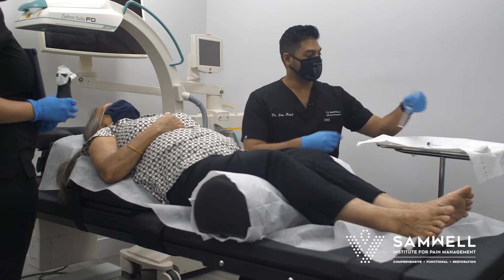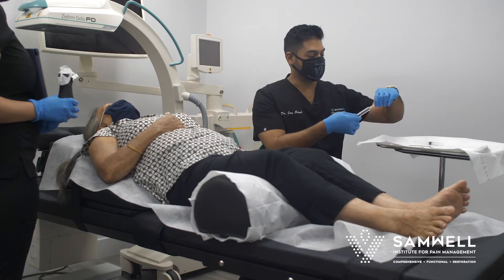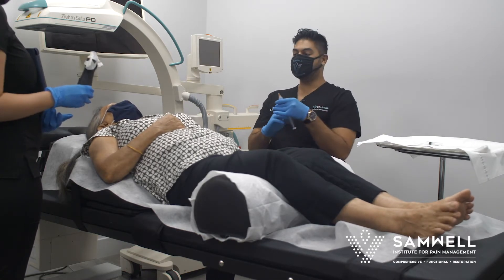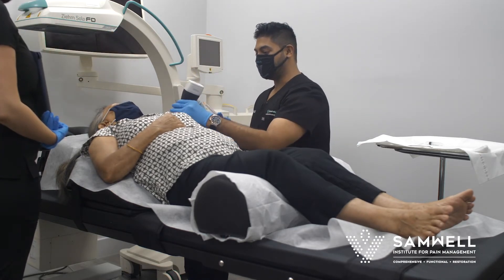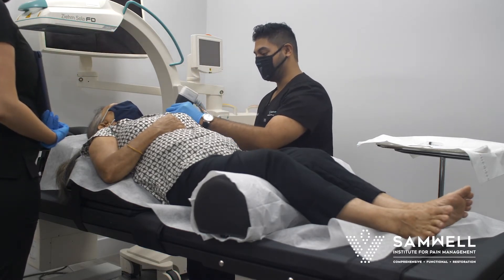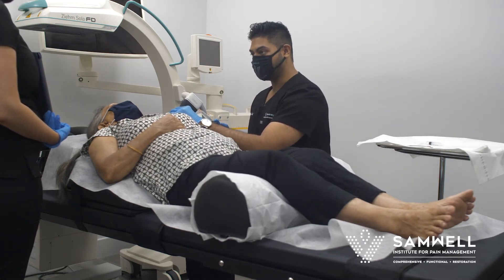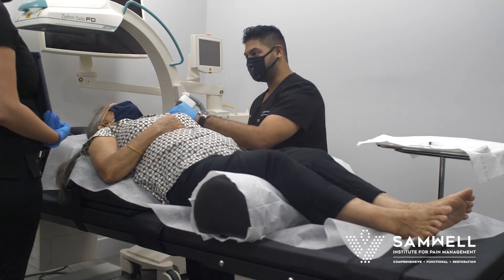We just prep the area here with some antiseptic solution and we're going to localize the skin. We'll take a few seconds to familiarize ourselves with the anatomy. We have an ultrasound probe connected to our screen and we're going to view some of the structures in the shoulder with our wireless ultrasound connected to an HD screen.